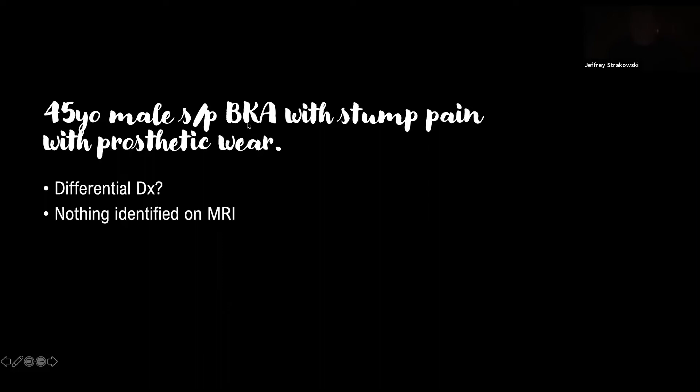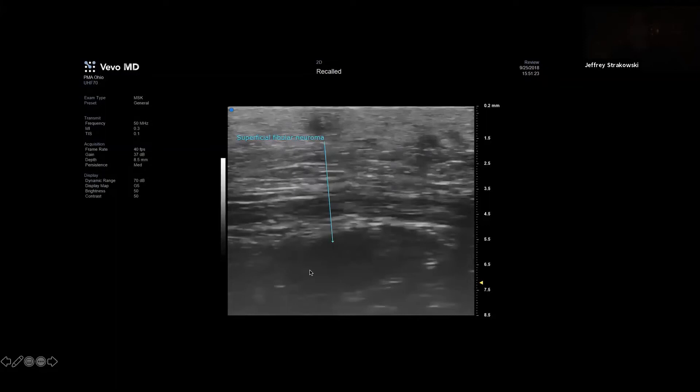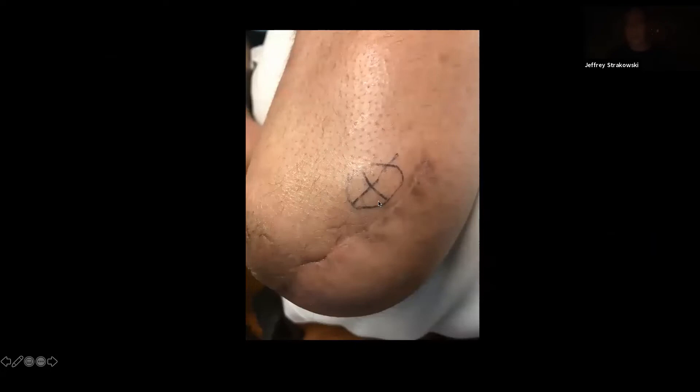Here's a quick case — someone with a below-knee amputation who's having stump pain. This shows how ultrasound can be used to find a stump neuroma. We can follow the superficial fibular nerve to the area and know exactly which nerve is being affected, which helps with treatment and decision. We were able to treat this specifically and help them start wearing a prosthesis — the pain was in the superficial part, not actually in the scar, just an enlarged neuroma there.